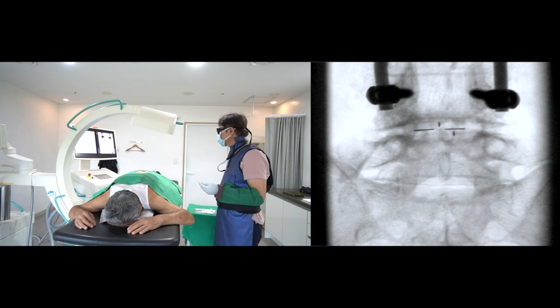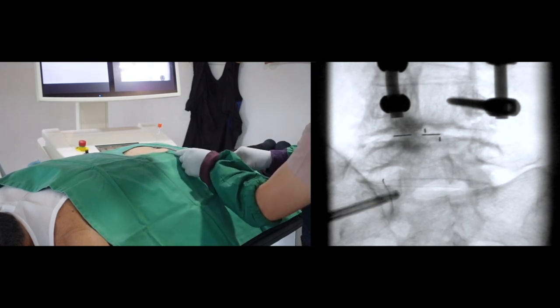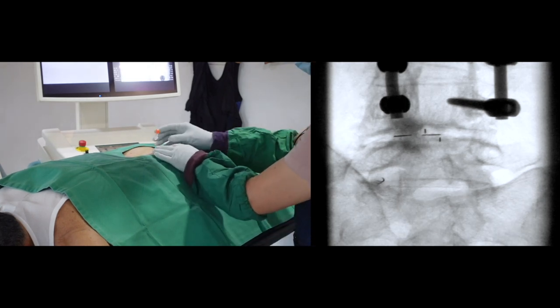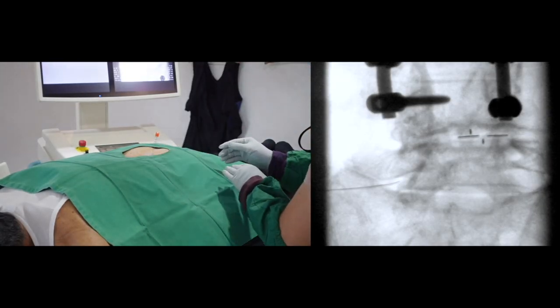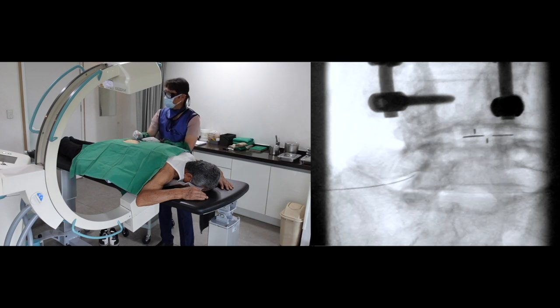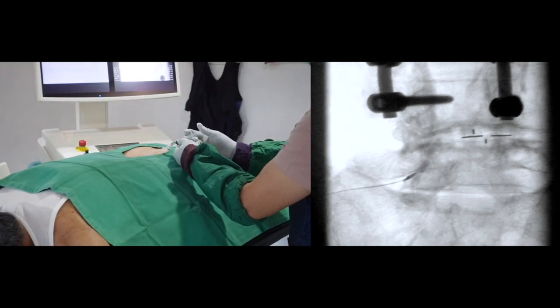Let me show you the third case. It is an easy case on the lateral oblique view. The only concern is the high iliac crest. I will go directly to the contralateral oblique view. The contrast spread is good.